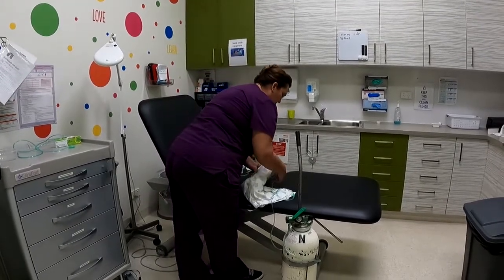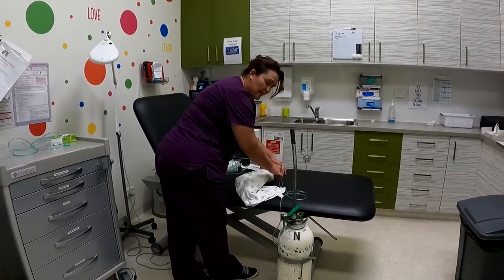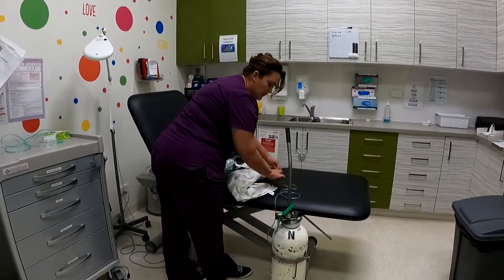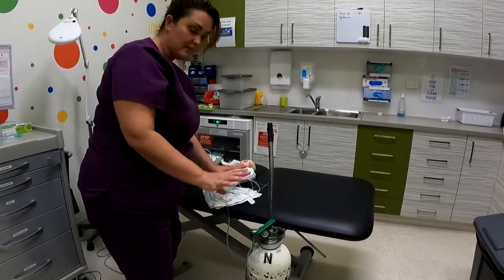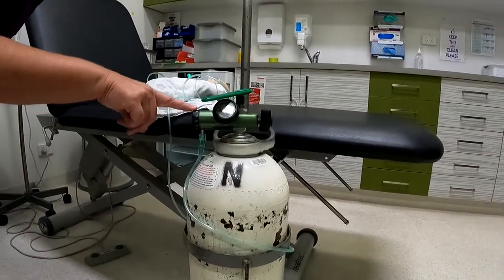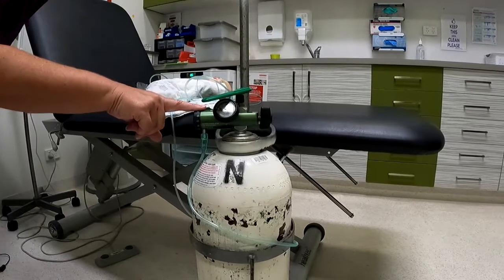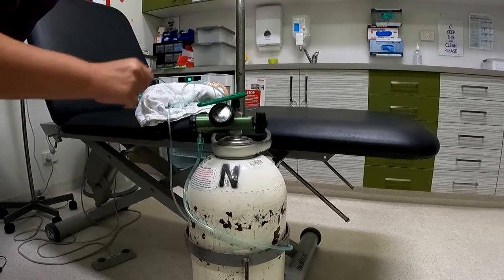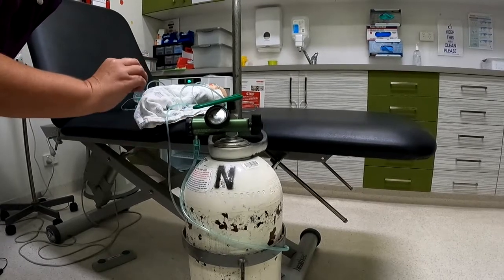Then work your way along the tubing. Make sure there's no kinks. Make sure things like the tubing and any toggles aren't causing any uncomfortable spots on your baby. Then you want to just work along the tubing, because again, you're going to have all of that extension, so just make sure everything's connected. Make sure that it's connected to the oxygen and that the oxygen's turned on to the proper amount that it should be on. One of the biggest reasons I get phone calls is that someone's thought someone else turned the oxygen on when they changed tanks or anything like that. So it just means that you're picking any problems up really quickly.